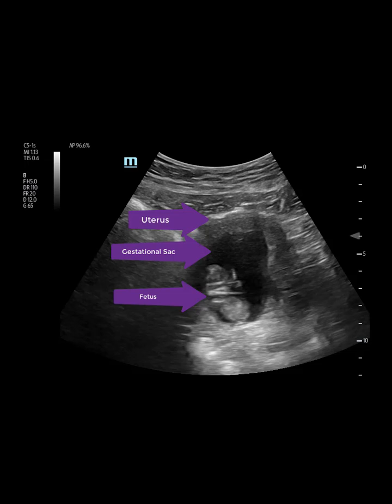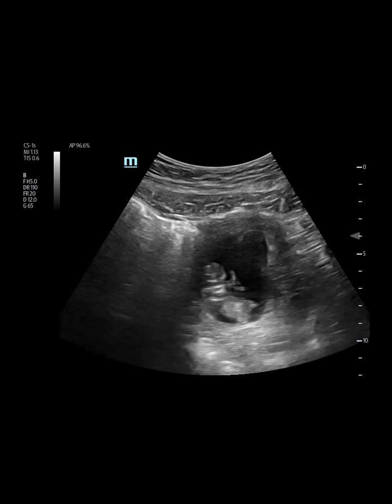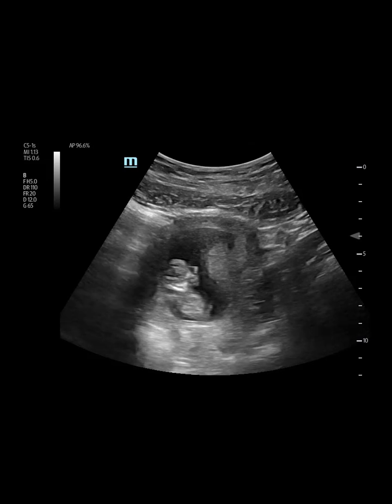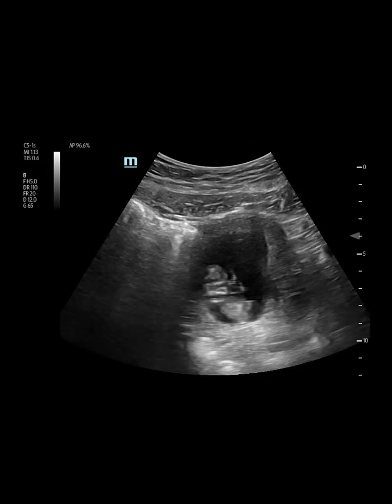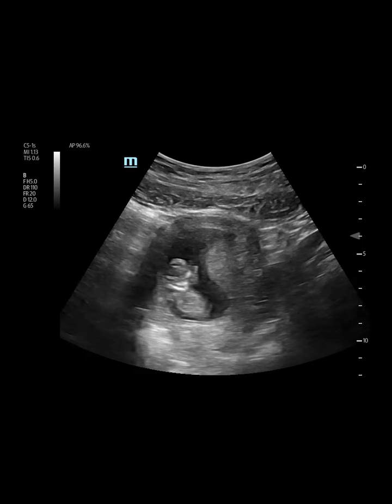There's a ton of details you can learn about fetal ultrasound, but for these purposes, we're going to try and keep it simple for what you need to really know on an emergency bedside scan. Unlike performing a FAST or perhaps a gallbladder scan, the fetus can be oriented however it feels like, so sometimes you have to start in a sagittal and switch to a coronal and manipulate your probe to get your best images. The first video clip that I like to save is of active cardiac pulsations.